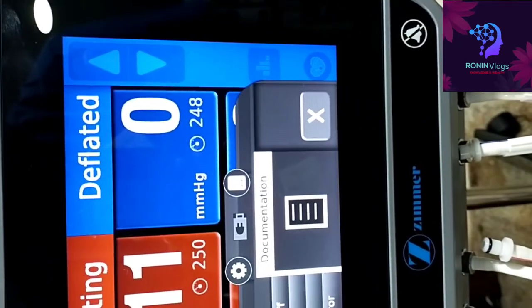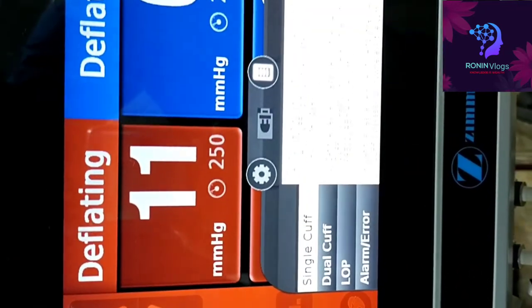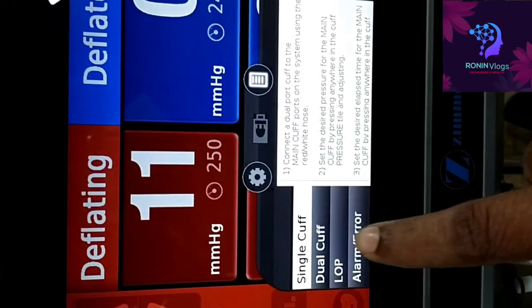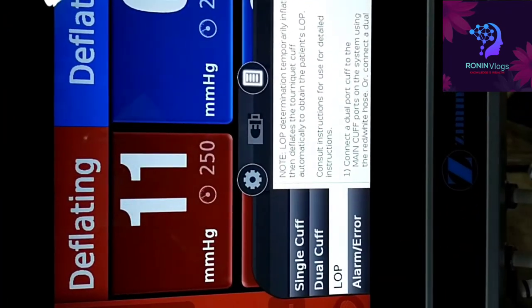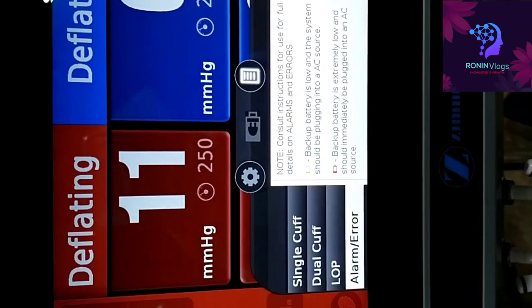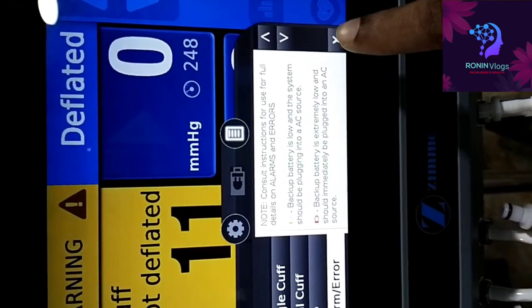Now another, the documentation. It will give the information about dual cuff, LOP, alarm, error, like that. Information is available here in this option.